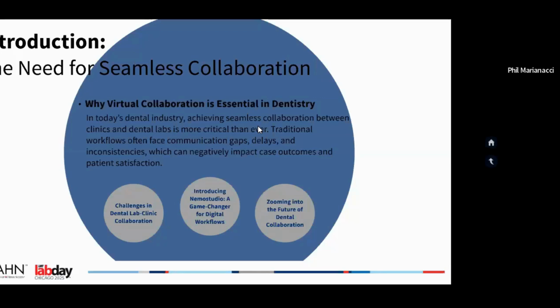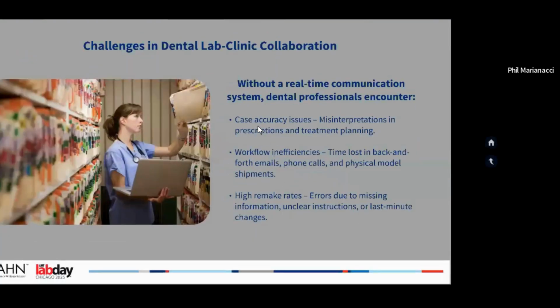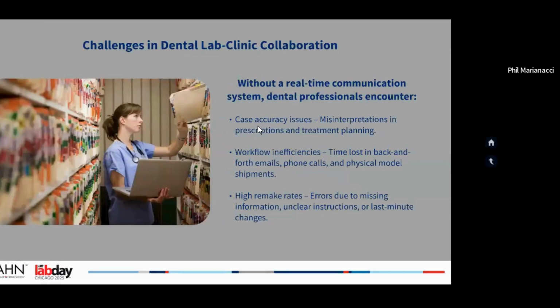And so the more that we have things all in one place makes my life a lot easier, and all of ours. So some of the challenges in the dental lab clinic, and you can relay this to most of all the people here who are lab technicians, is really having more of a real-time communication that can be instant and not being phone calls or text messages or things that get missed. You have one technician that is taking a text message and it doesn't get recorded. The information doesn't, they're on vacation and it's not all in one place. There's a higher chance of having errors.